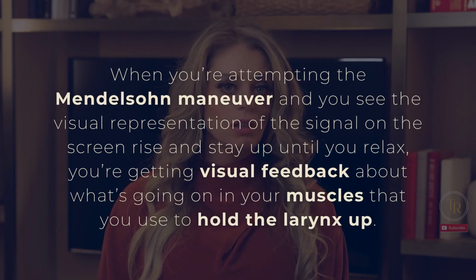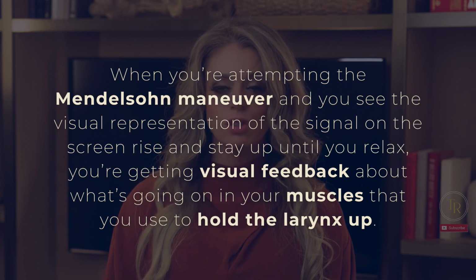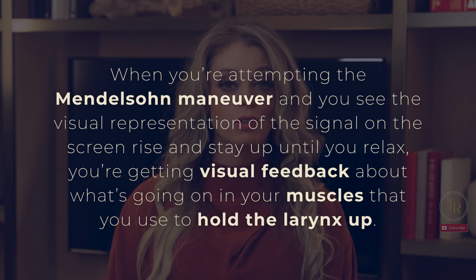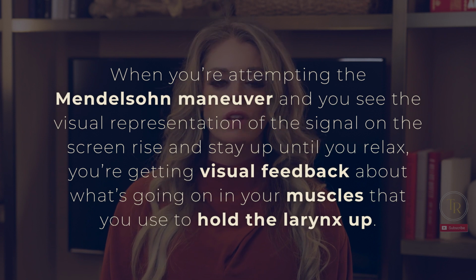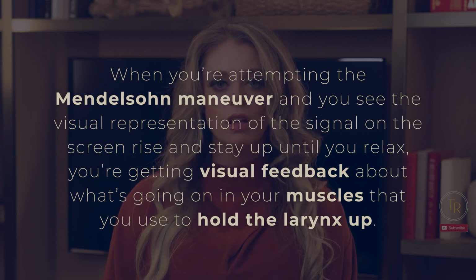When you're attempting the Mendelsohn maneuver, for example, and you see the visual representation of the signal on the screen rise and stay up until you relax, you're getting visual feedback about what's going on in the muscles that you use to hold the larynx up. Although this may not happen on the first try, just like any other new task that we attempt.